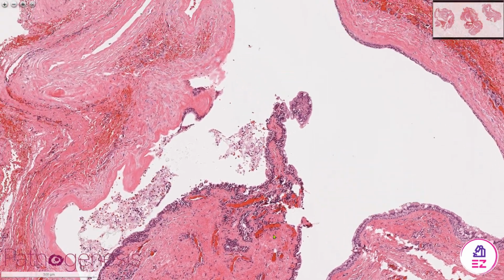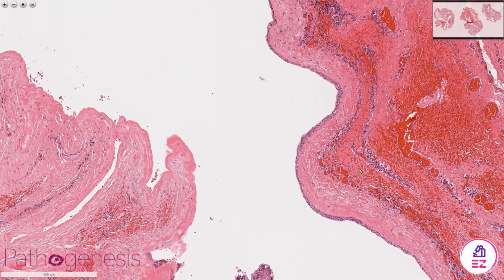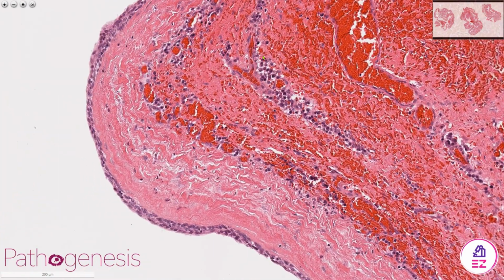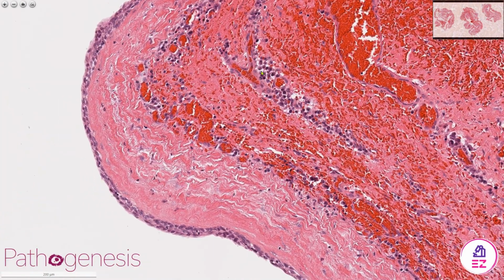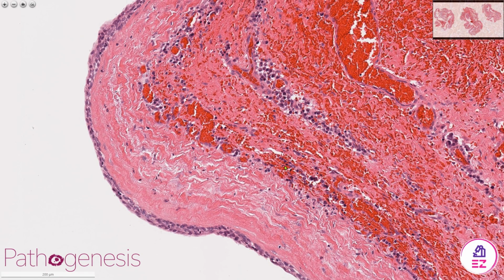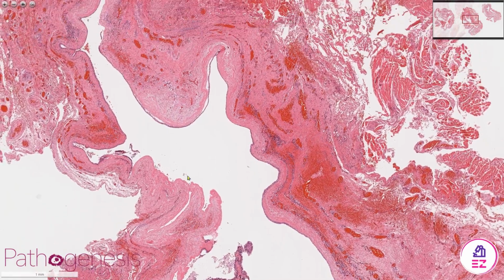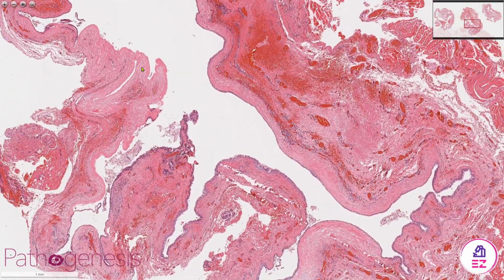This is a developmental cyst, so within the cyst wall you wouldn't expect to see much inflammation. There are a few areas where we've got plasma cells congregating, and sometimes you'll see that if the lesion is being traumatized. But this is a nasolabial cyst. It's fairly straightforward to diagnose.